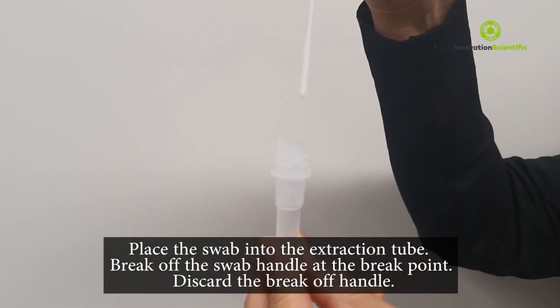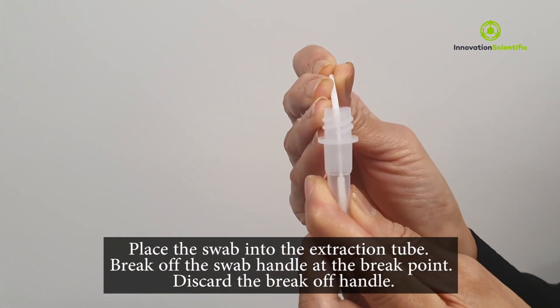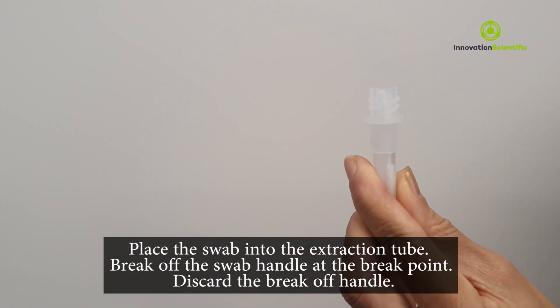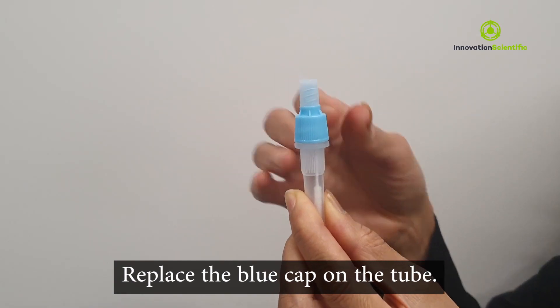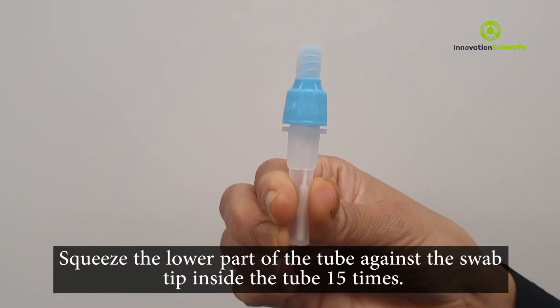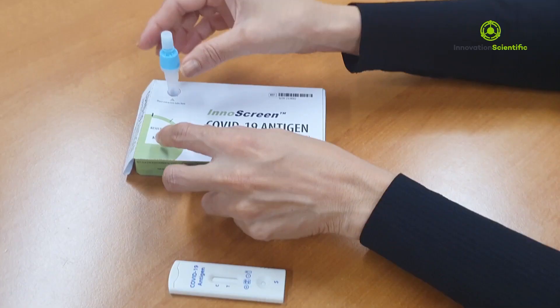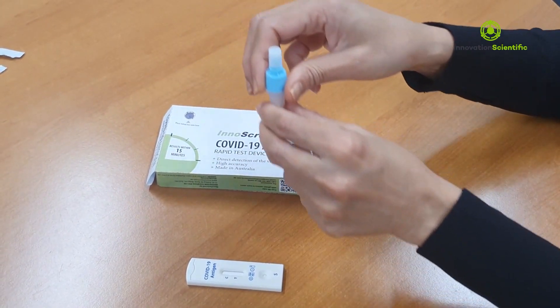Place the swab into the extraction tube and break off the handle at the break point. Discard the break-off handle. Make sure the tip of the swab is first in the solution within the tube. Replace the blue cap on the tube. Squeeze the lower part of the tube against the swab tip inside the tube 15 times. When the swab head is squeezed, the sample is released and mixed in the solution in the tube.